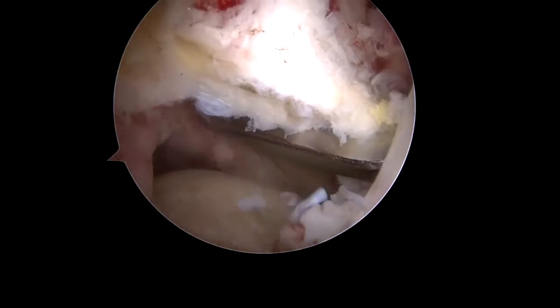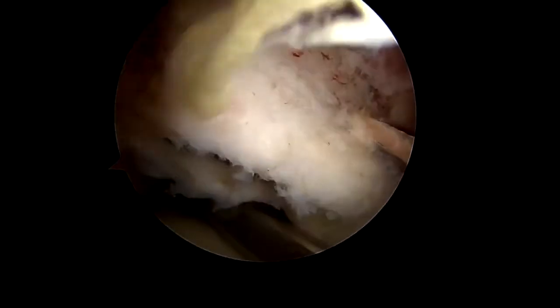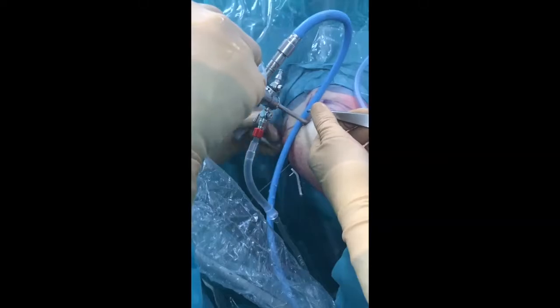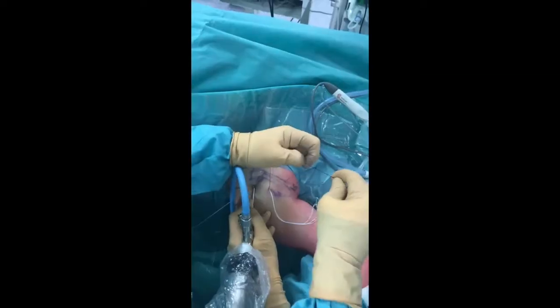The half-pipe is removed and the glenoid tunnel is drilled. A switching stick is used via the west portal to retract the subscapularis muscle whilst drilling. The drill guide is removed and the drill cannula left in situ to allow passing of a PDS shuttle suture, which is retrieved via the west portal along with the bone-linked sutures.